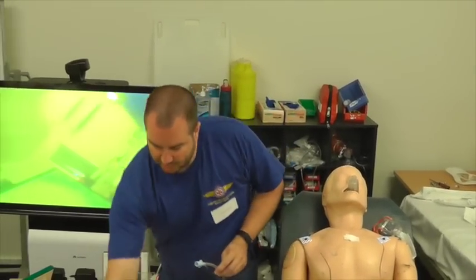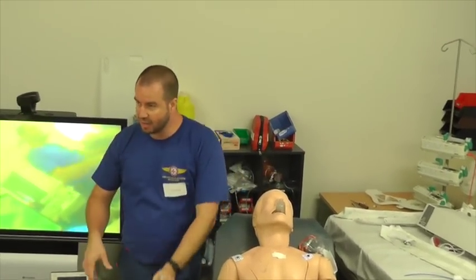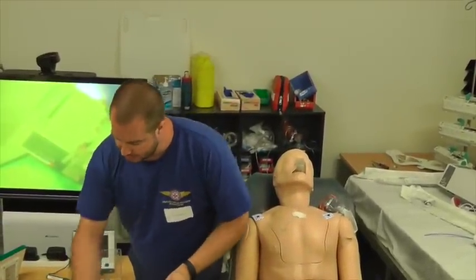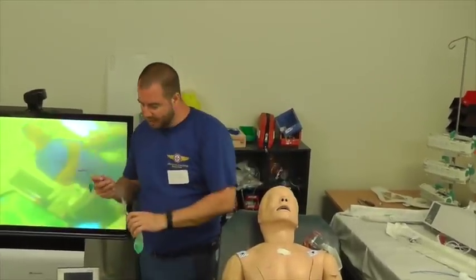And then what we're going to do is we're going to go through that and put it through with the scope, find the vocal cords and straight through. Remember, these patients are going to be ventilated, not awake, self-ventilating. Now the trick is, if you MacGyver up your own system, we've found there's problems with them.